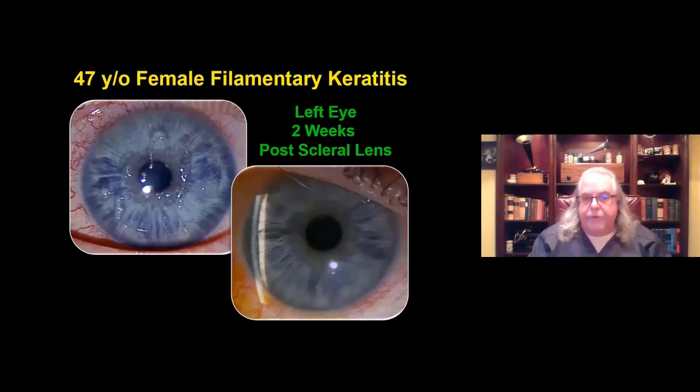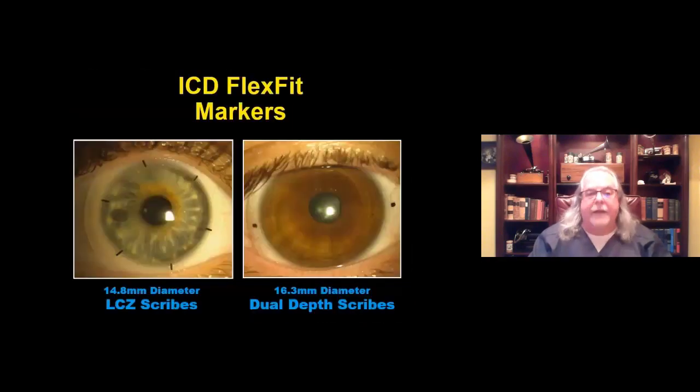weeks after wearing the scleral contact lens. What a dramatic improvement we see here in this individual. These lenses work virtual miracles in relatively short periods of time for many of these patients with ocular surface disease.